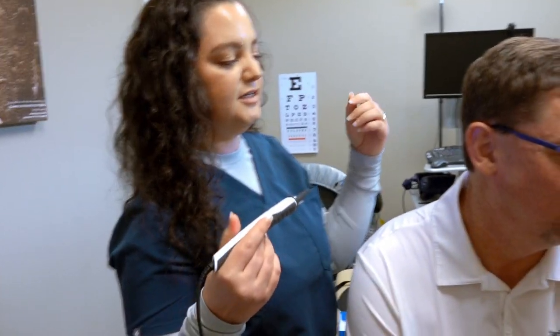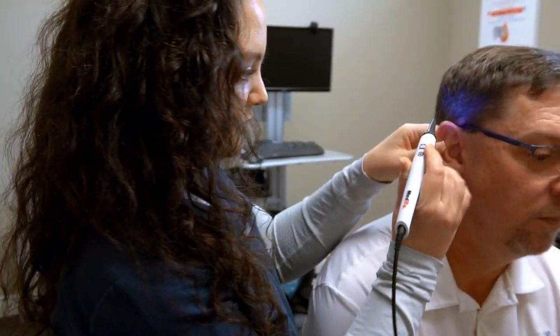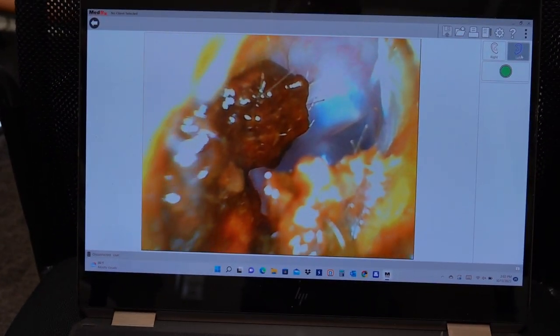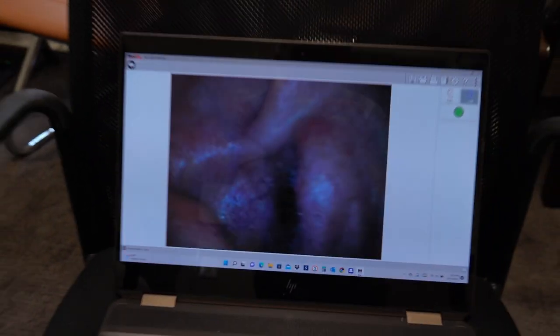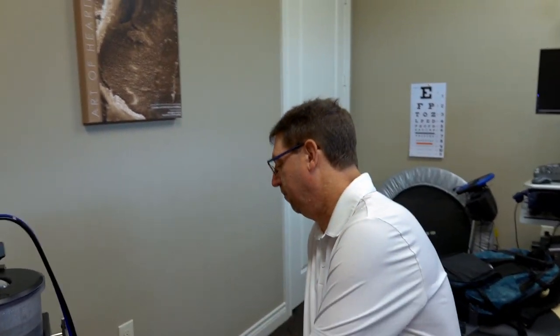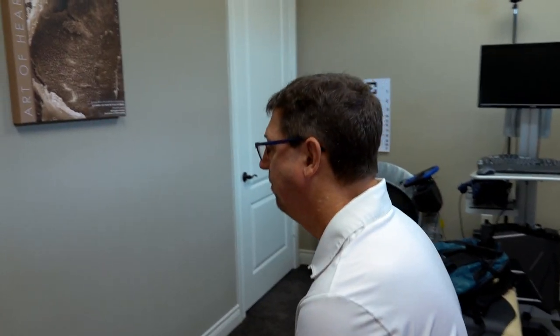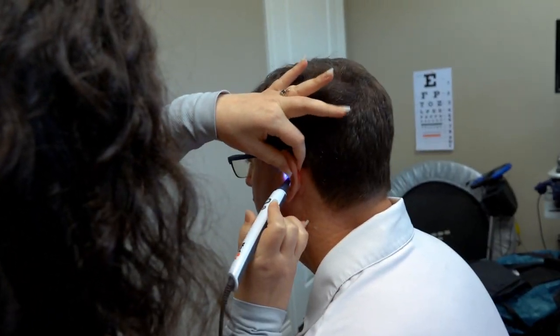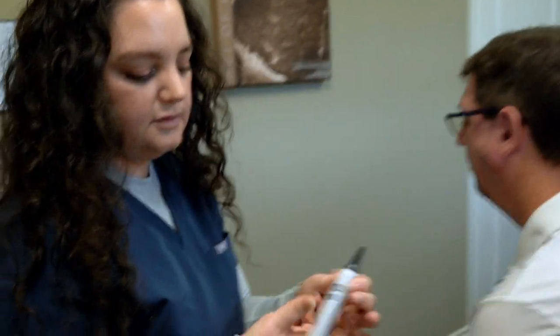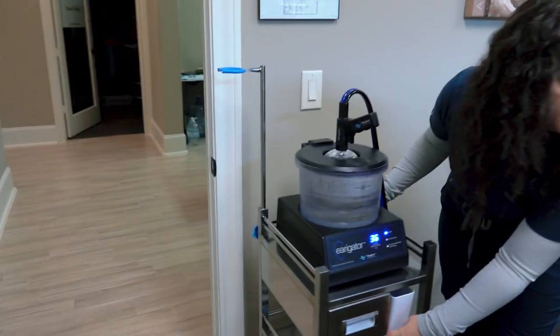First we're just going to take a look in the ears so we can see what the blockage is. Oh yeah, Dr. Scott — not completely blocked. On the other side? Let's have you turn to face the other wall. Not as much on this side, still definitely some we can get out though. All right, let's do it.